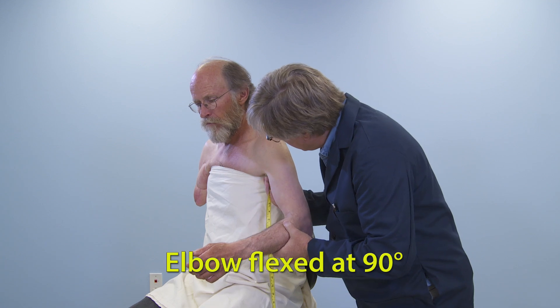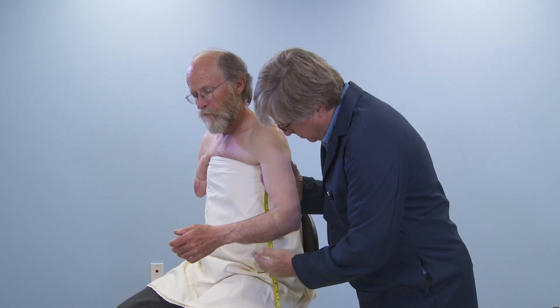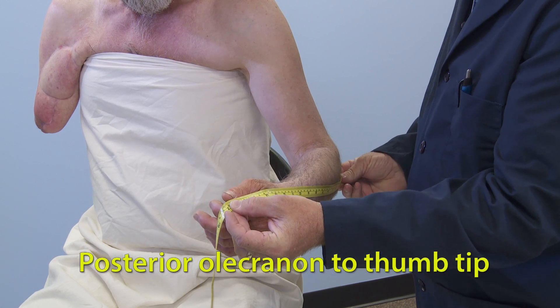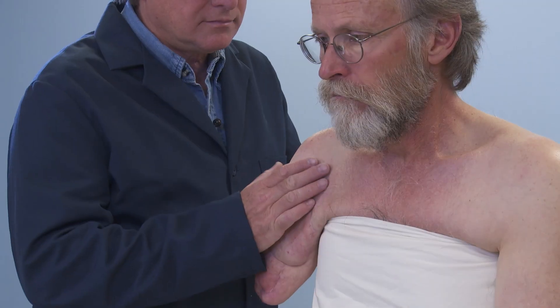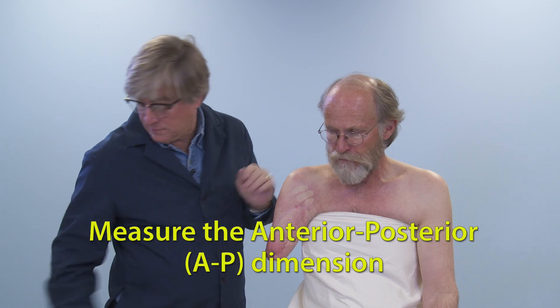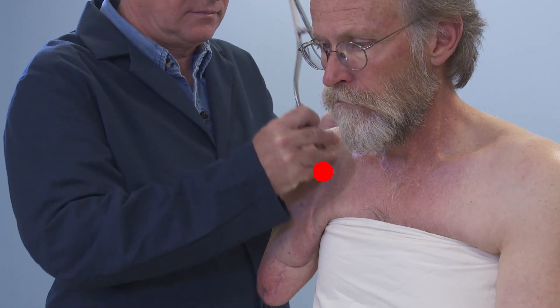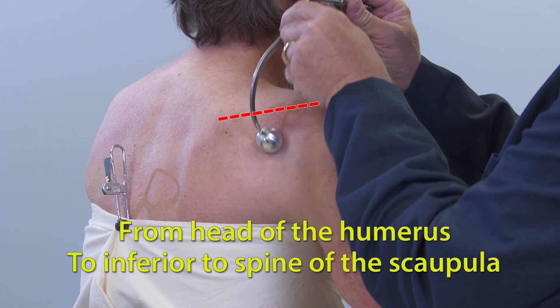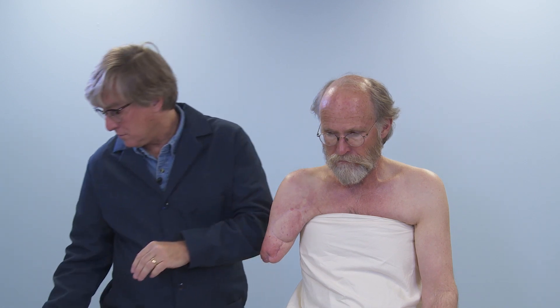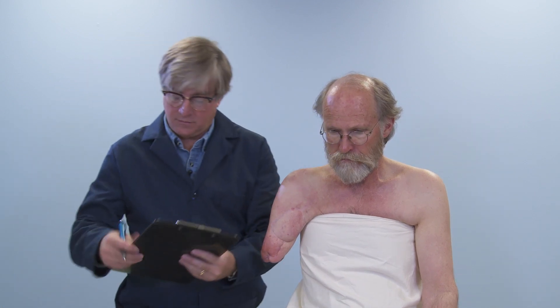With the elbow flexed at 90 degrees, measure the humeral section of the sound arm from the pectoralis tendon to the olecranon, and posterior olecranon to thumb tip if a unilateral patient. This will give you correct measurements for the prosthesis length. With bilateral patients, charts can be used, but most likely the patient will determine what length is most functional. Palpate the head of the humerus and the spine of the scapula. Measure the anterior-posterior dimension with a pair of outside calipers with a smooth surface, taking this measurement from the head of the humerus to a point inferior to the spine of the scapula along the line of progression. Care must be taken with this measurement so that it is reproducible on the positive model. PTB calipers may also be used for this measurement.